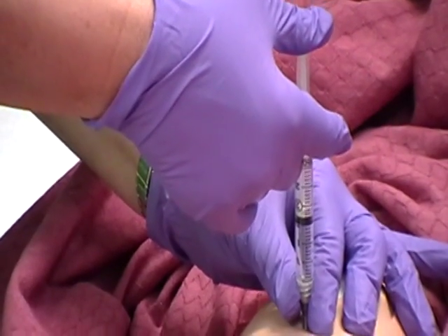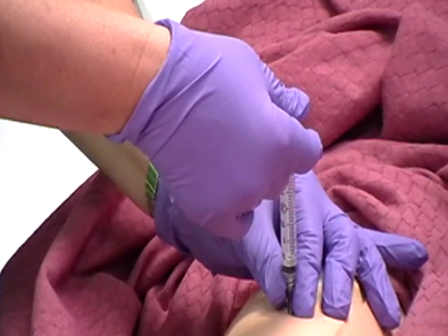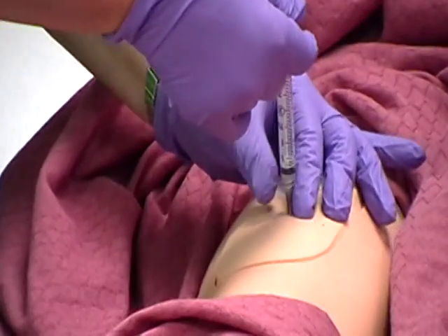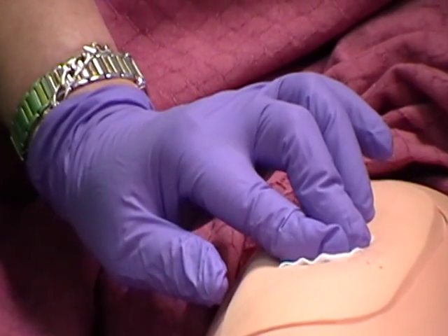Inject medication slowly at a rate of 10 seconds per milliliter. Wait 10 seconds. Then smoothly and steadily withdraw needle while applying antiseptic swab gently over site so skin does not drag.